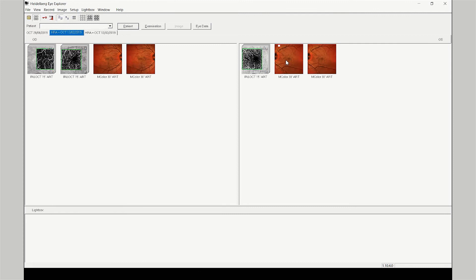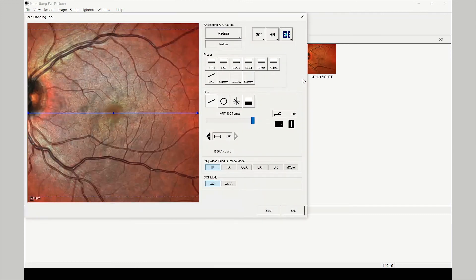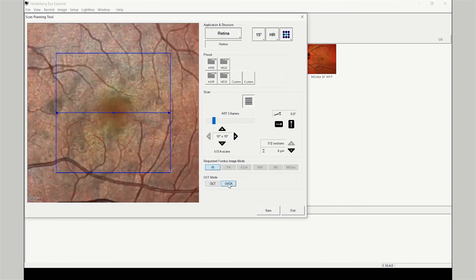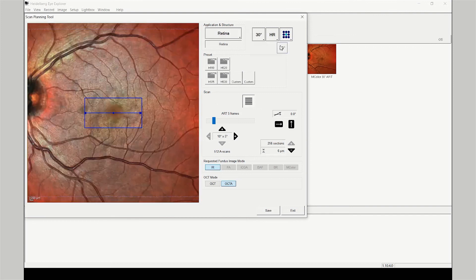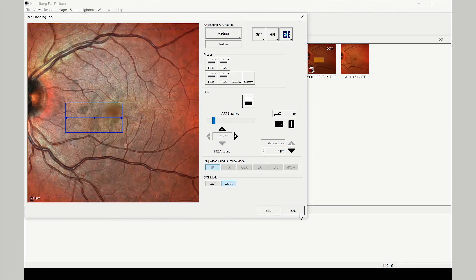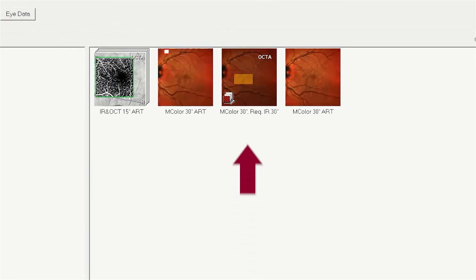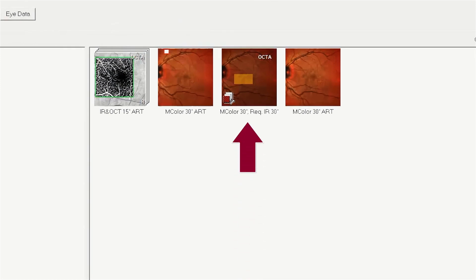Launch the scan planning window using a right mouse click and selecting the scan plan option. From this window, the OCTA scan pattern can be selected, the field of view defined, and the location of the scan placed. Save and exit the scan planning tool. The OCTA scan pattern defined by the scan planning tool appears as a reference scan with a yellow OCT pattern.